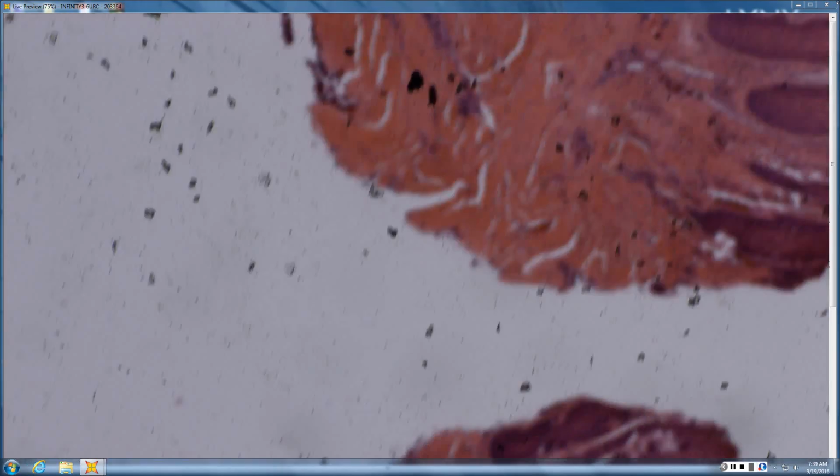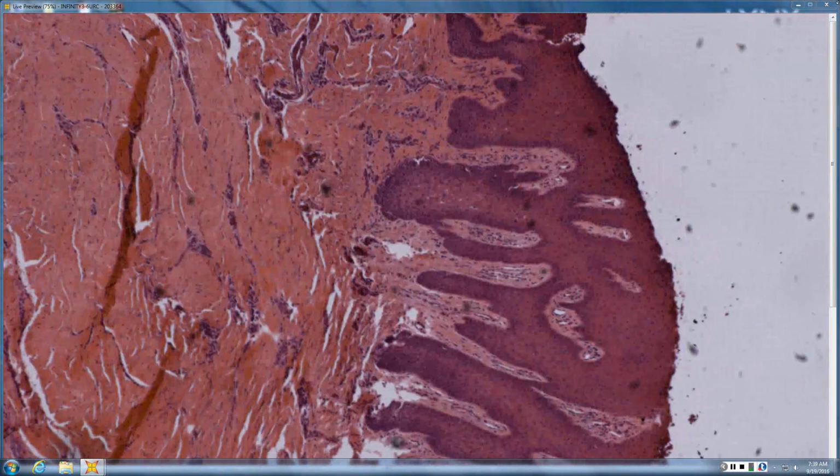This particular one was a drug eruption in an HIV patient with a mixed inflammatory pattern, but at least it gets you to that mix. Mixed patterns give you a differential with drug sort of at the top.